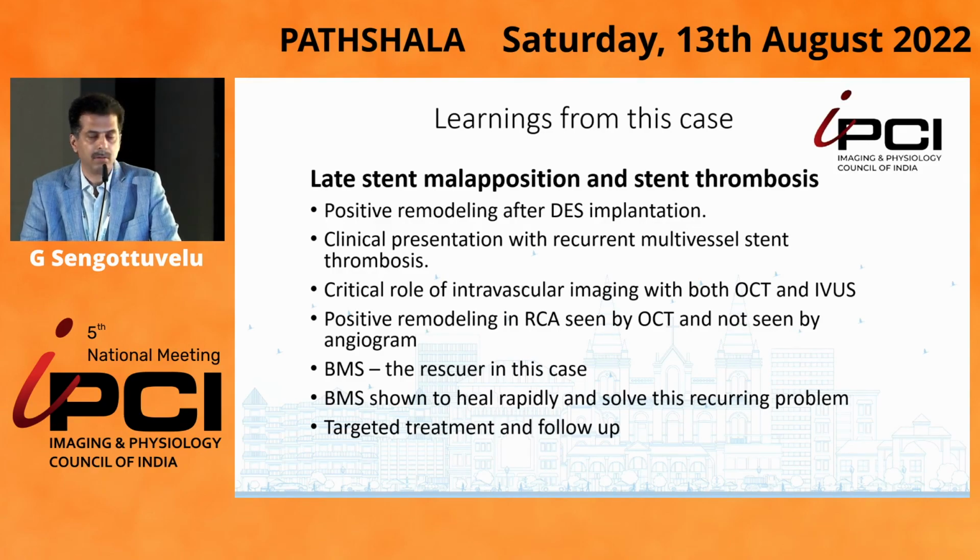Giulio, my thought process would be not to deliver more drugs. Here, you just got a few options. Either appose the stent and keep the patient on a single antiplatelet along with anticoagulation, or you try and close that. If it's too huge, if it's aneurysmal, you have covered stents. And if it's not, create neointimal hyperplasia and fibrosis to try and seal up those areas. And I think he managed that.